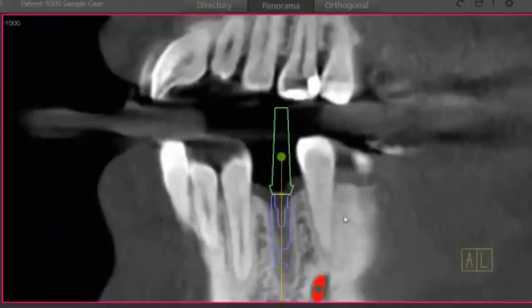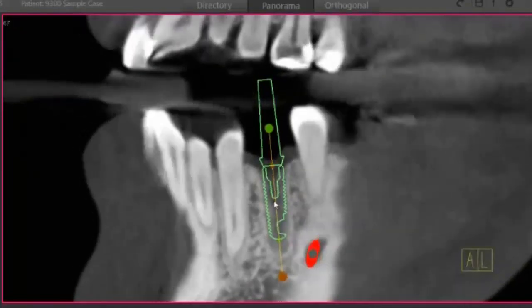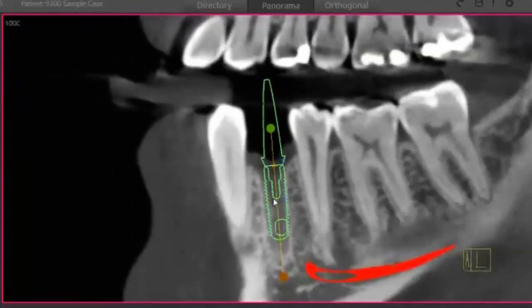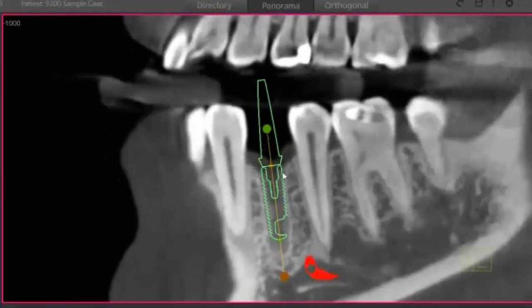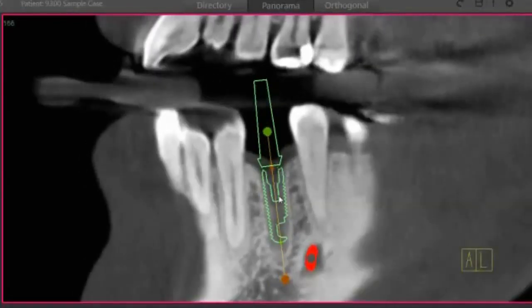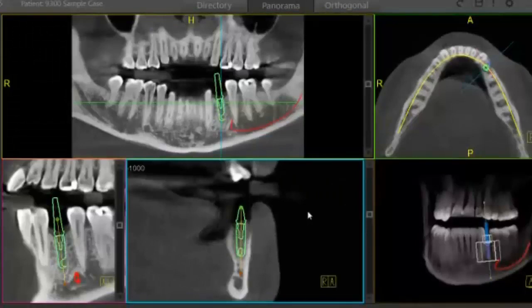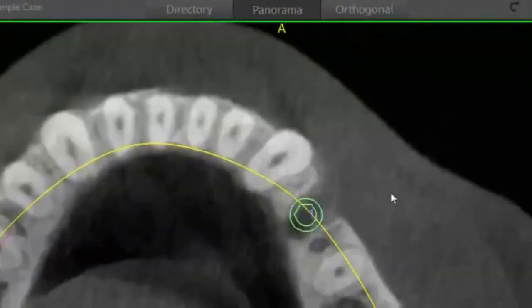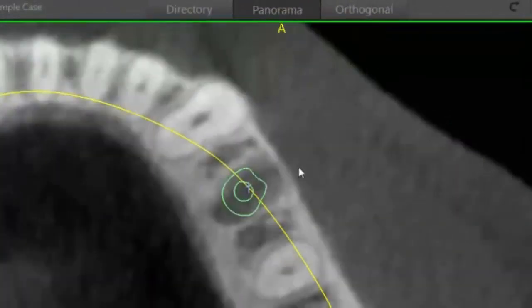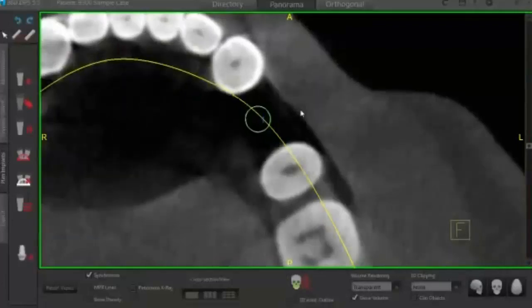Once you're finished there, we'll move over to our transaxial view. This allows us to roll around the implant as opposed to through it the way the cross section does, so we can really get our angle down. We can check our mesiodistal spacing. Then we can go up to the top right to our axial view, get right over the center of the implant, and roll through our slices.